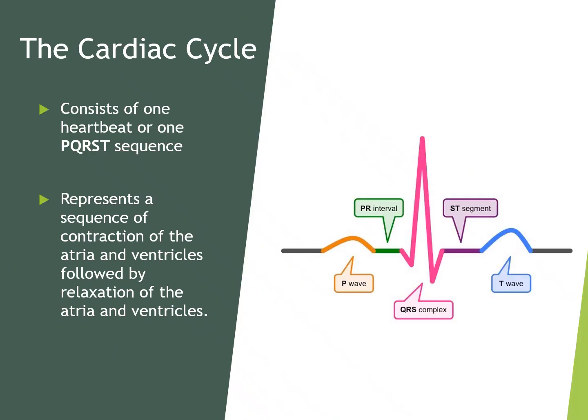As a nurse working on the medical unit, you will not be expected to interpret or analyze cardiac rhythm strips for our med-tele patients. We wanted to include a brief overview of the cardiac cycle components and potential rhythms to enhance knowledge and improve communication skills between us and our colleagues in ICU, and ultimately be able to provide the best possible patient care. This Essentials of Basic Rhythms course was developed from the Full Basic Rhythms course, which spans over 2.5 days. It is comprehensive, in that it goes into more detail of rhythm analysis and management.